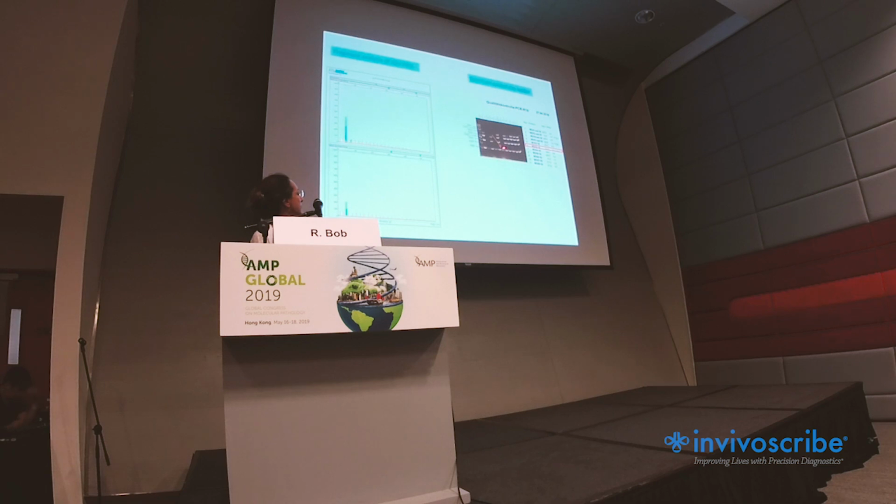Most of the DNA fragments are only 100 base pairs long. So that's the reason that we always apply DNA quality and quantity tests for all of our samples before applying clonality analysis. It's against the recommendation of some references. They say first apply the investigation. If you cannot interpret the result, then come back and do the DNA quality and quantity test. But I really don't recommend it. It's a waste of time and resources.